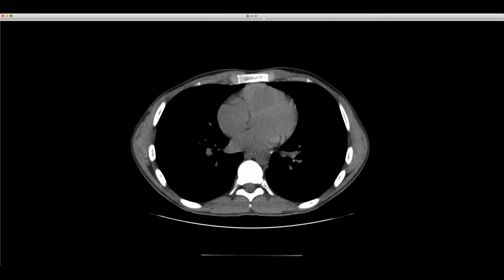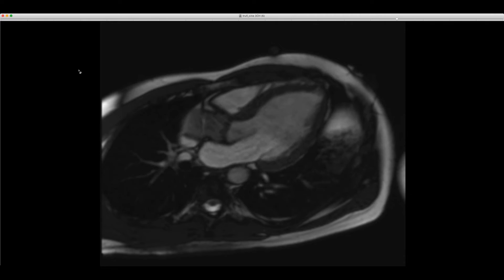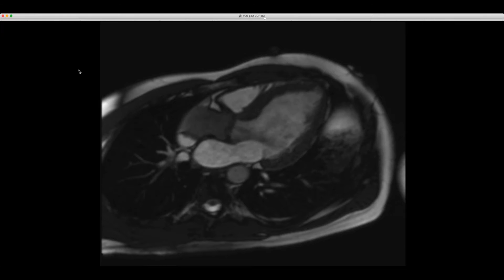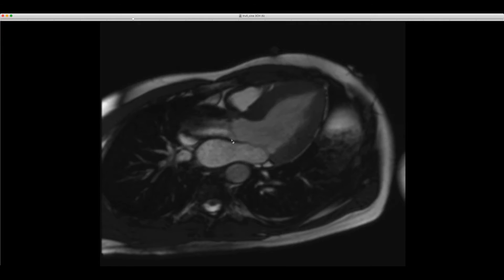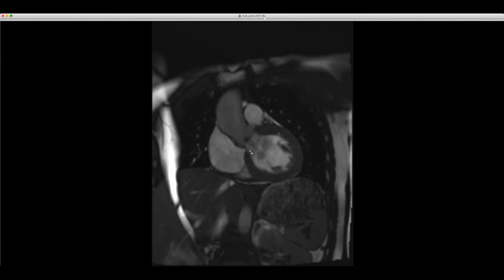The final case from this presenter is a 29-year-old who came in for cardiac MR for aortic stenosis. The aortic valve was abnormal on echo, and on MR you can see abnormal thickening of the valve leaflets with flow acceleration across the aortic valve suggesting stenosis, as well as a regurgitation jet. The short-axis view through the valve shows it is stenotic with a jet of insufficiency.